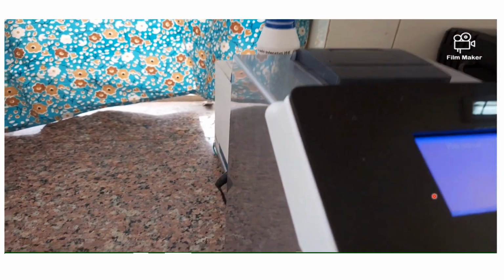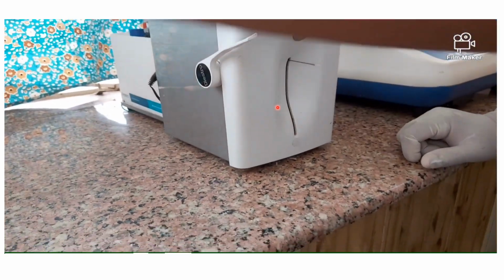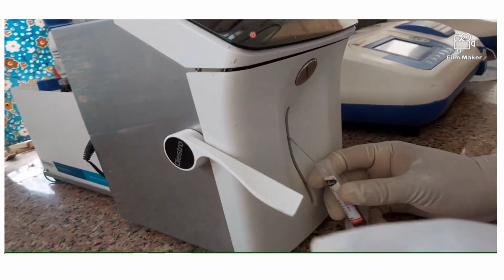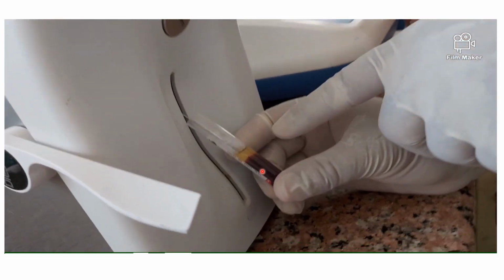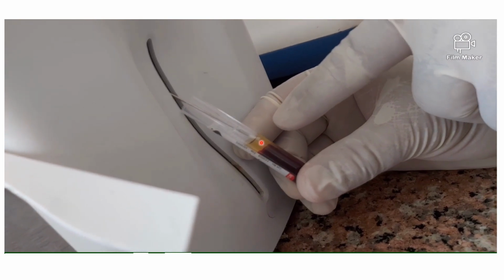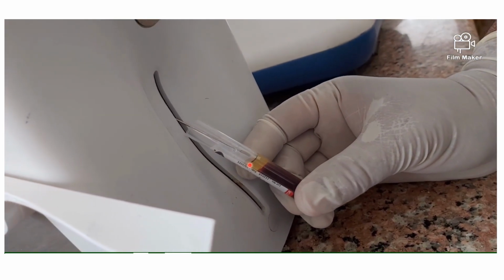Now we'll see how the equipment functions by demonstrating one serum sample. This is the knob which you have to put down which will help the probe to fix at 15 to 20 degrees. And now the serum sample will be filled in. The probe should not touch the blood cells.